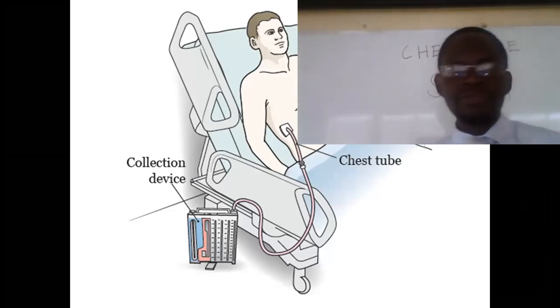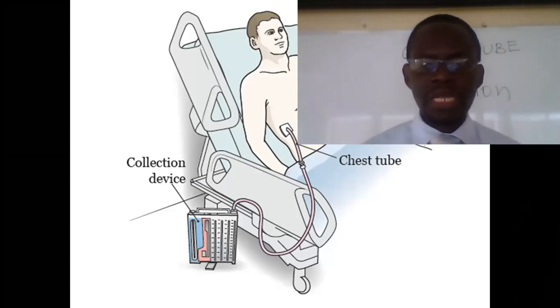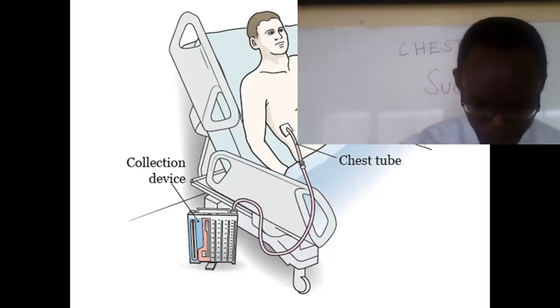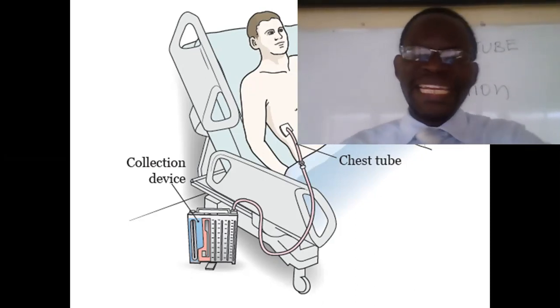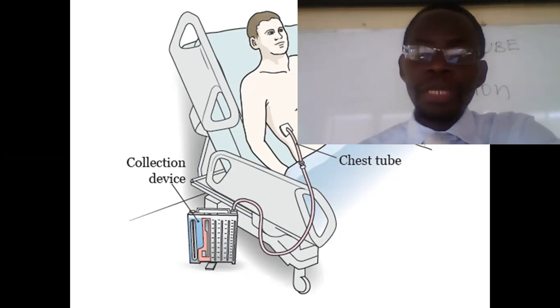It collects from the patient until the little bubbling within the water seal chamber ceases. That basically means there is no more air being collected.